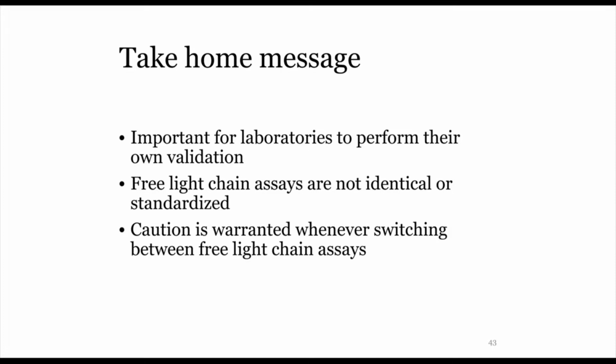Well, we believe that antigen excess is probably the most likely cause. We did not specifically save the specimens to do further analysis, because the way that we did this study, we essentially set up the instruments based on the instructions provided by the manufacturer, and Abbott was the one who set up the assay for us.